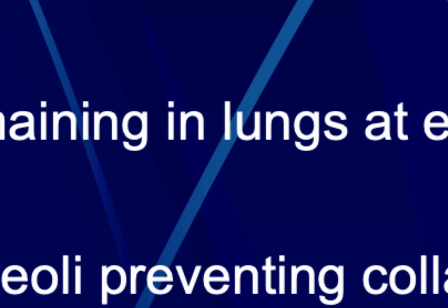So make sure that you guys are doing a really good job explaining this process to your patient. I know sometimes, specifically with CPAP, the calls that you are using CPAP on could be a little rushed, where you feel, or you know, that this is beneficial for the patient, and I think us as providers rush that without actually explaining it to the patient.